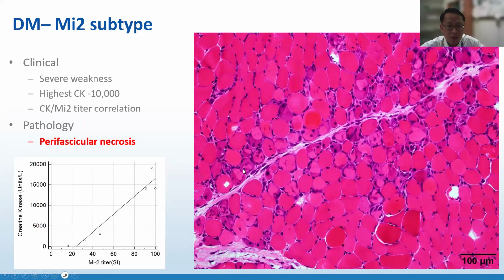So getting into the specifics, there are 5 dermatomyositis specific autoantibodies, and we start with the MI2 subtype. Pathologically, this is distinct by itself. It has a very prominent perifascicular necrotizing pattern as shown in the picture here. You can see these very washed out fibers, they are necrotic fibers, and they lie along the perimysium here. You can also see regenerating fibers, and there is no obvious smooth perifascicular atrophy here. You can have some atrophic fibers, and those are mostly composed of regenerating fibers, interspersed by normal sized fibers.